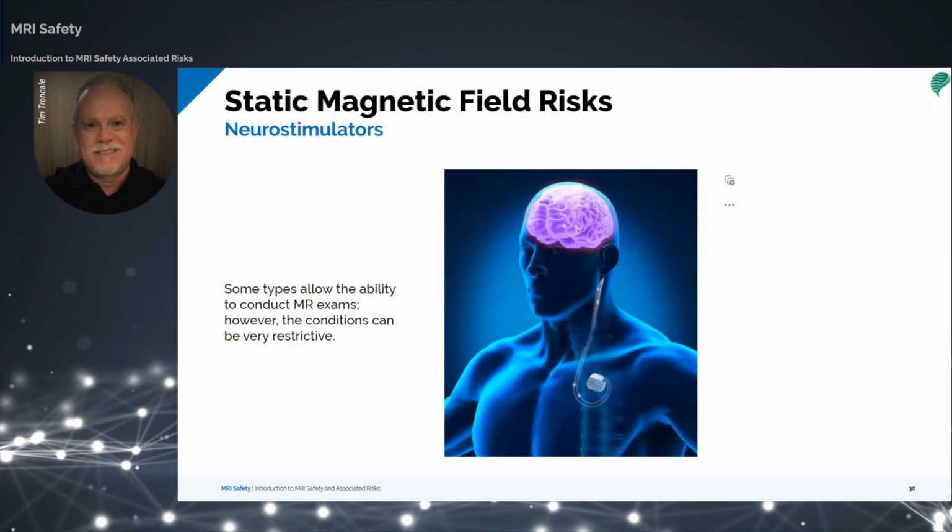Neurostimulators are also of concern. Most are contraindicated, even if they are no longer functional. These devices pose potentially hazardous or fatal results. Some neurostimulators are MR conditional. Examples of these are neuro pain stimulators and bladder stimulators.